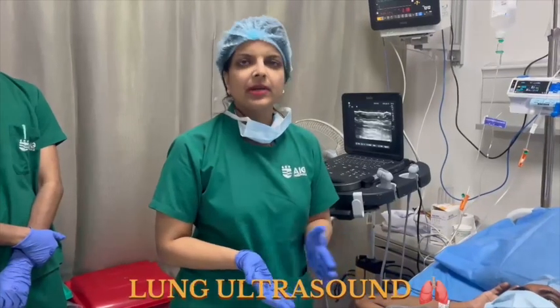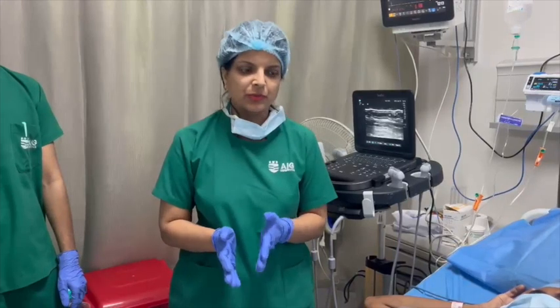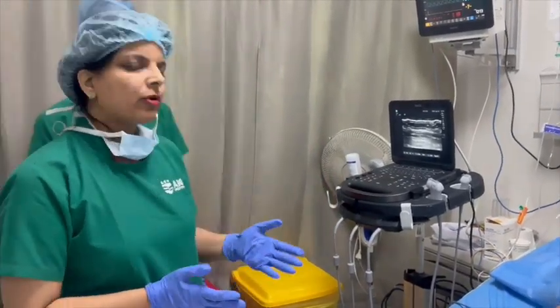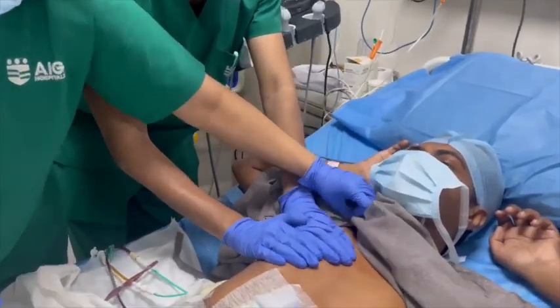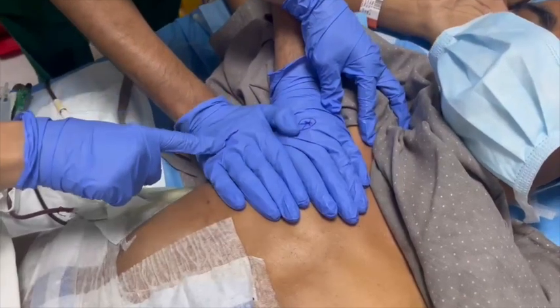Today we will be demonstrating lung ultrasonography, how we do it in our ICU regularly. It's a part of POCUS which we do regularly here. We follow the BLUE protocol here. BLUE protocol stands for bedside lung ultrasound in emergency. Here we follow 2 points. As you can see, we recognize 2 points first, that is blue point 1 and blue point 2.